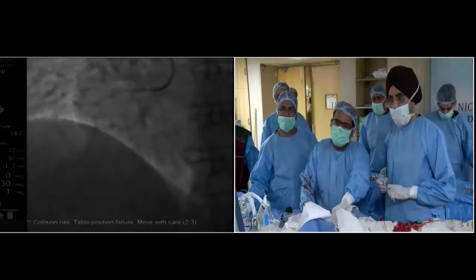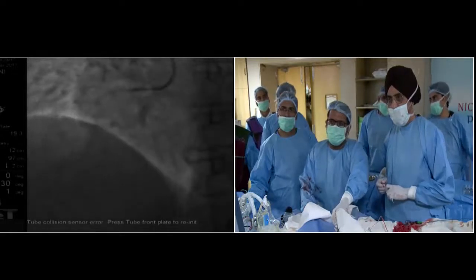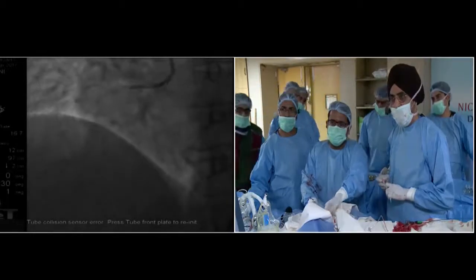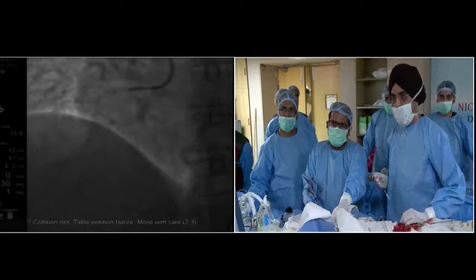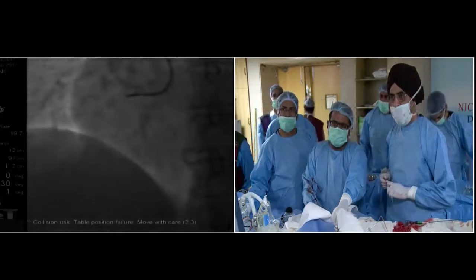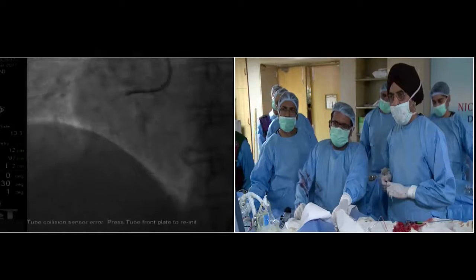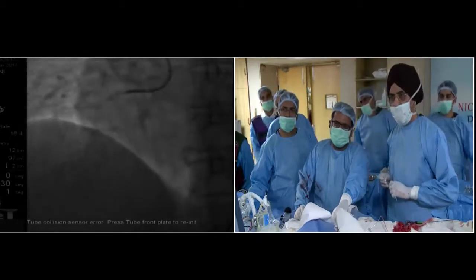Is there any way we can improve the image quality of the angiogram? And there is another reason why, if the patient refuses surgery, I would like to go for the left system: that we can follow up and get back to the RCA later on also.